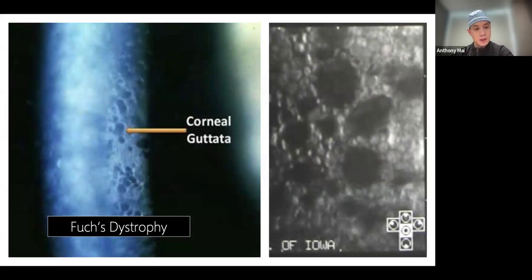And this is what's known as Fuchs dystrophy. So sometimes we'll get this scan just to confirm, or perhaps they don't actually have Fuchs dystrophy, but there are other things going on, just some corneal edema that we don't know what it's from. This scan is able to help us decide, is the endothelium intact? Is it healthy? Or is something else happening that's not coming from the endothelium?